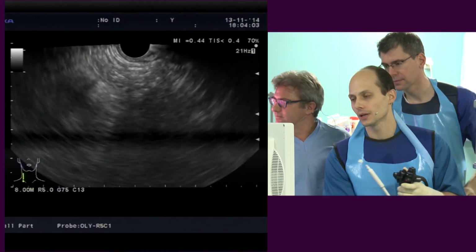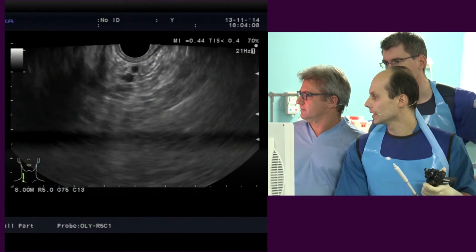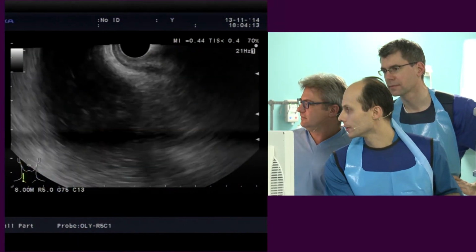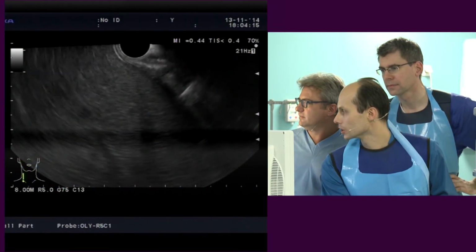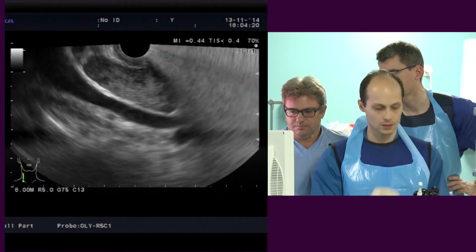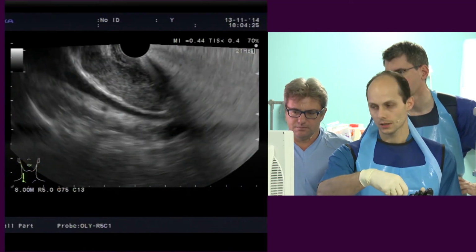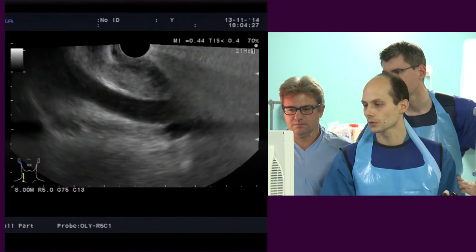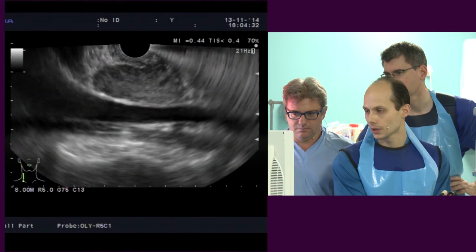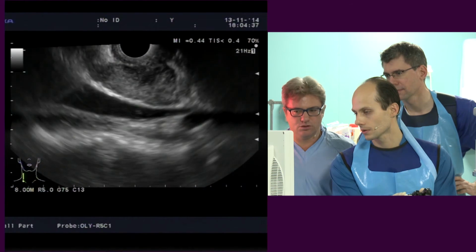We had to go back a little into the stomach to see if the needle is out of the endoscopic channel. Now we have to go to the duodenal bulb, to what we saw. Now you see it again. I will put the slit in place. And now you can see how the needle is out.